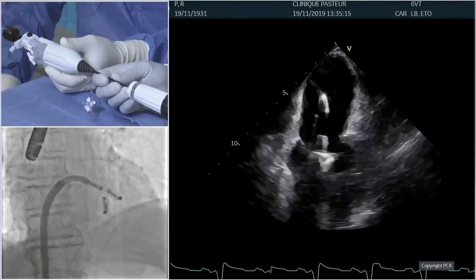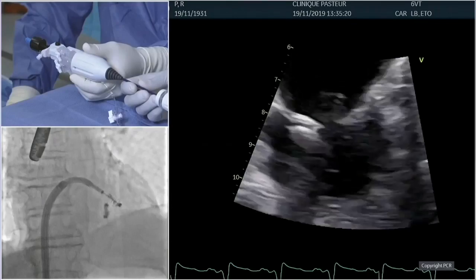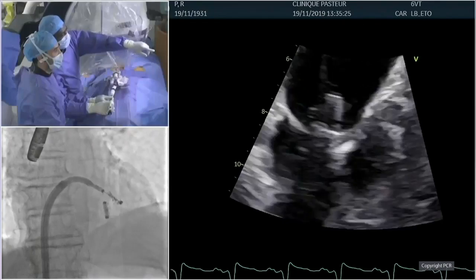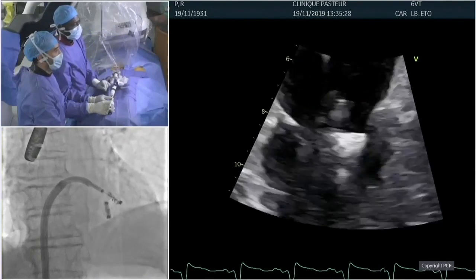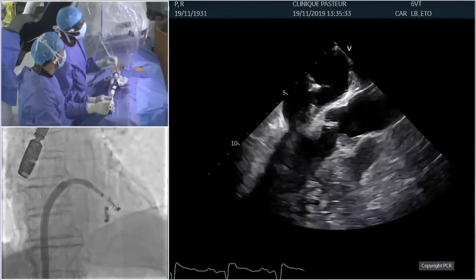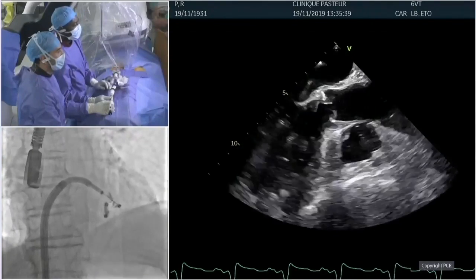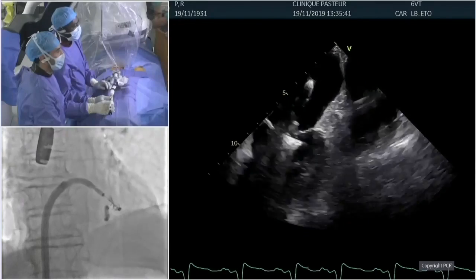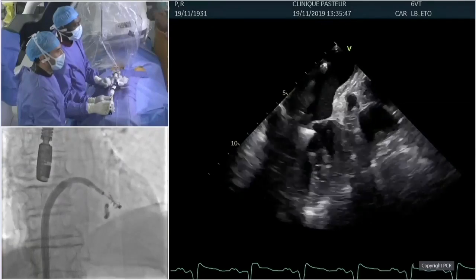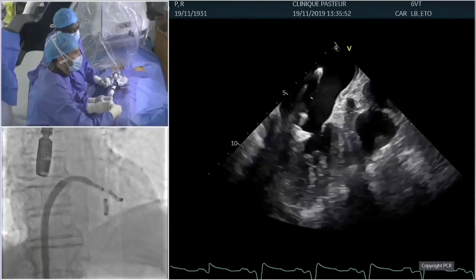It's not easy to measure if you really want to objectively assess that. It depends a little bit on the anatomy. I think the tissue bridge is similar in many cases, but the restriction of leaflet mobility varies a little bit. And I really try to make the point that just next to the tissue bridge, we have almost no restriction of leaflet mobility. And in some cases where you grasp a really big bite of leaflet, you see that during the cardiac cycle, the device is opening and closing just a little bit, implying that it allows to preserve the compliance and the mobility.